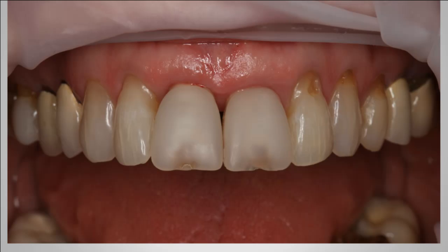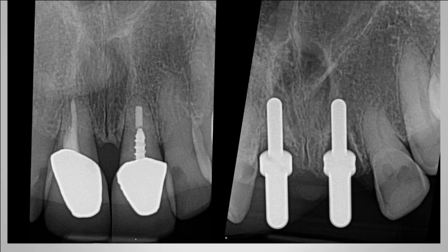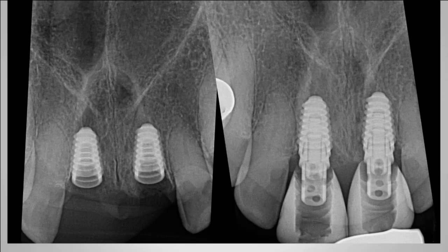Now for more complex situations, as you see here, this is a patient who is missing both tooth 1-1 and 2-1, number 8 and number 9, and she needed implants to restore 2 teeth that were failing. You can see both implants were placed and provisionalized. And at this stage, we use the same concept, using CEREC to scan intraorally as opposed to taking analog impressions.